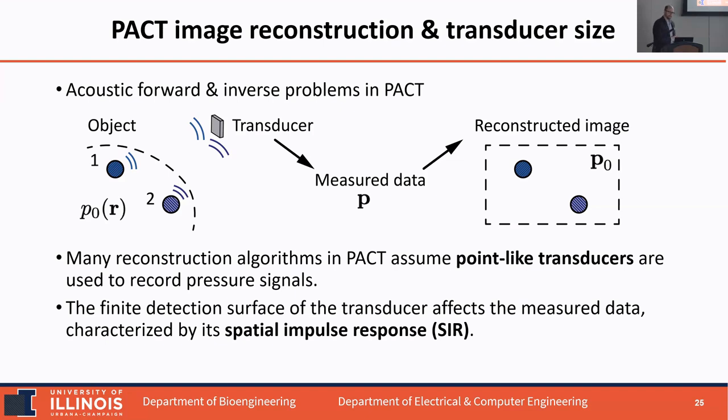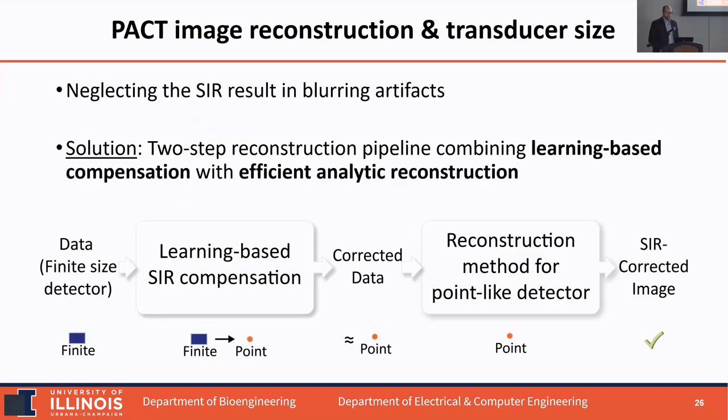The thing I didn't tell you before was that in practice, experimentalists like to use transducers that have large sizes, right? Because if you make the active area of the transducer larger, the sensitivity goes up. It's just like if you're doing X-ray imaging, you use larger detector pixels, you get more photons, you love it, right? But the price to pay, just like in that application, is you lose spatial resolution. You can compensate for that finite size effect in a model-based method, but again, they're terribly slow. So in this work, we investigated the use of a generalizable deep learning method for achieving that.